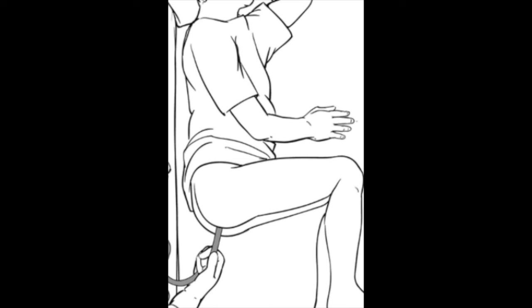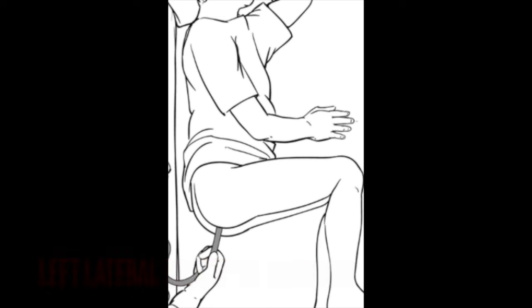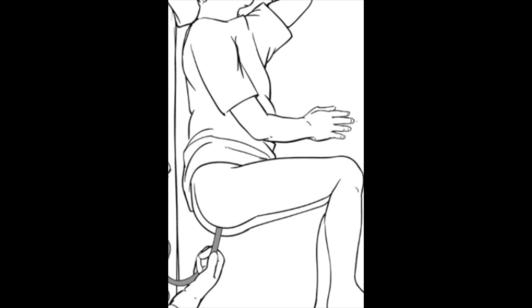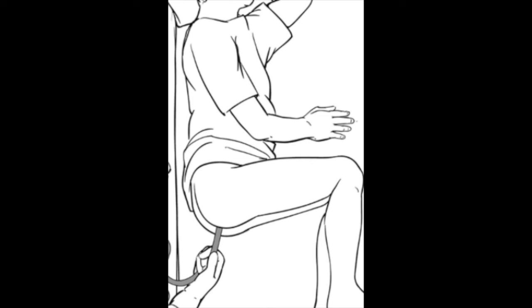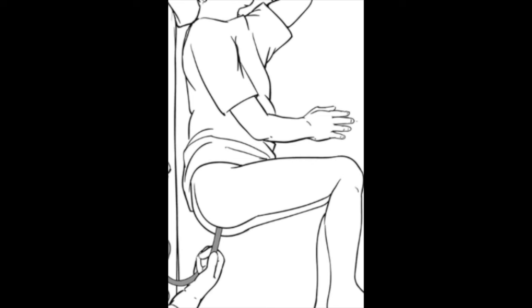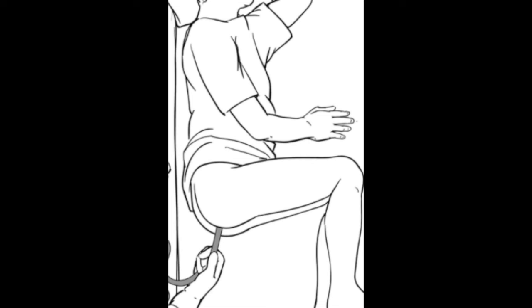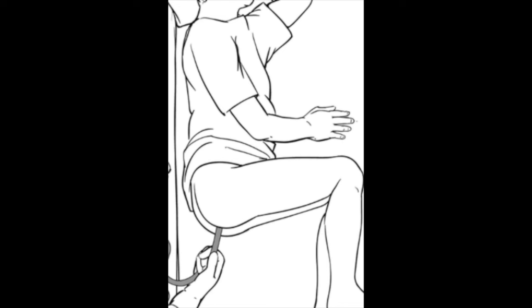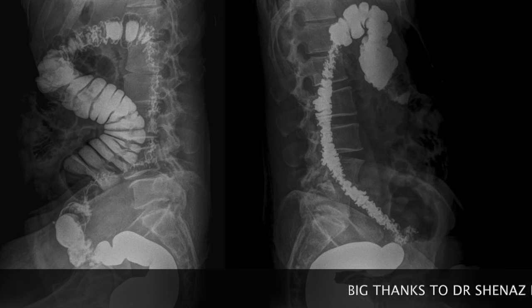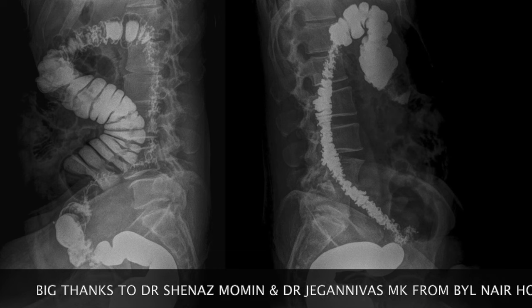The patient lies down for a digital rectal examination position and we pass a small tube connected to the barium can. The can's height for the enema should not be more than 3 feet and we slowly release it at a very slow speed. If released too fast, the patient might expel the barium on the table and it will be an absolute mess. Release it slowly into the rectum and initiate a comfortable conversation with the patient so they are distracted and the barium continues to enter the large bowel.